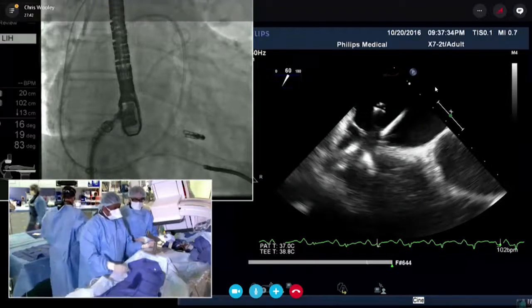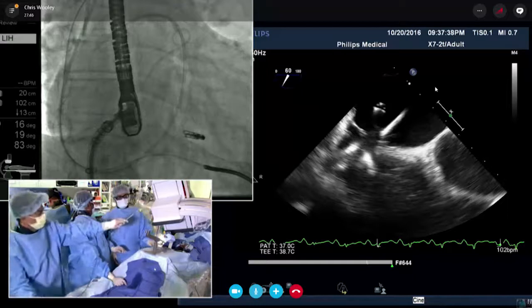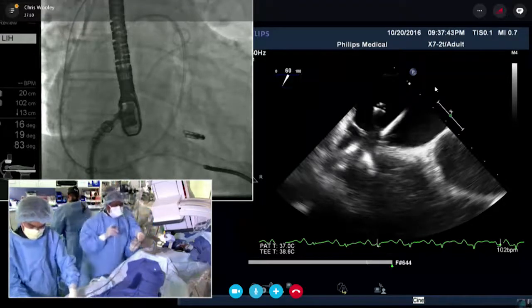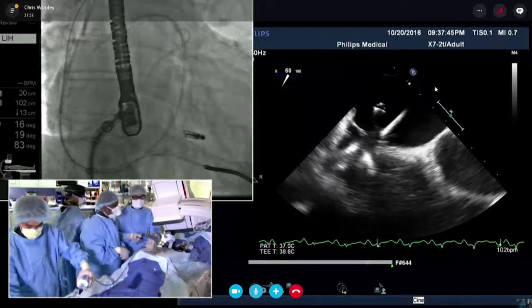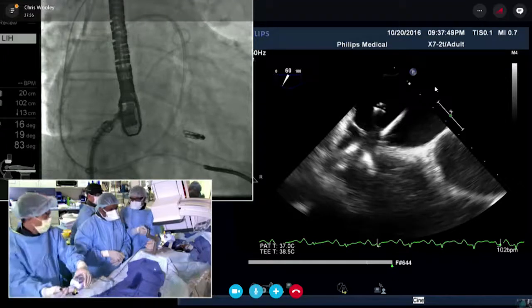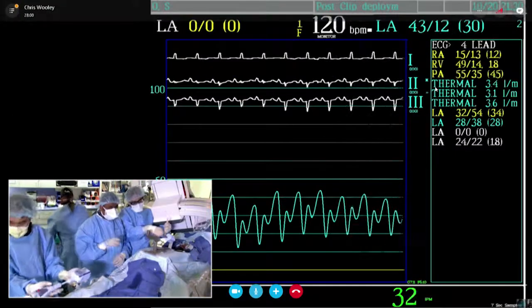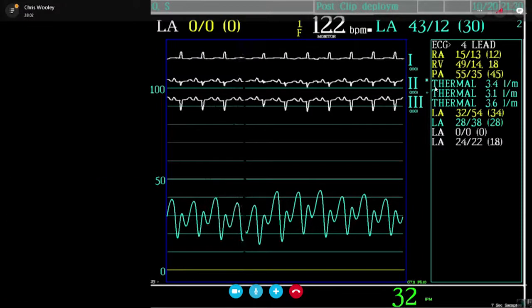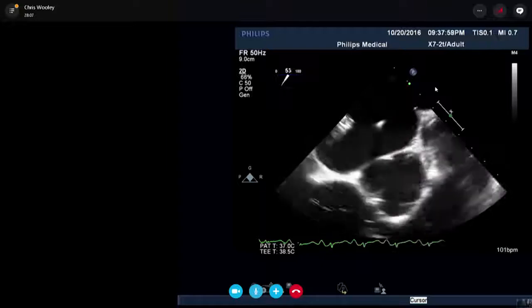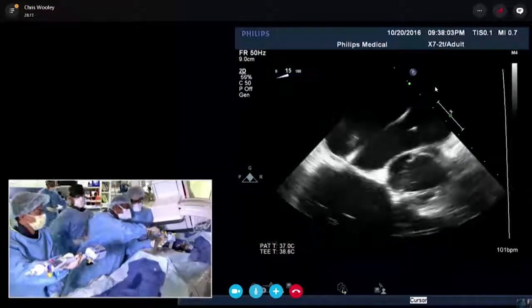So, okay, did you increase the pressure up? Yeah, so his pressure is improved from 90 to 115. Another thing, the anesthesia just told us that his pressure was 90 by 60 when we started. After the first clip itself, it has gone up. So just go back to echo. His aortic pressure has gone up already after the first clip. And that's usually a very good sign.